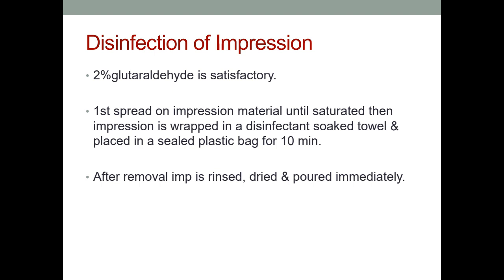This is indicated because if you keep it for more than 10 minutes, there are more chances that the addition silicone will be affected in its dimensions. So you have to take care that whenever you are disinfecting your impression, it should be disinfected for the particular time, and then you have to remove or wash it, dry it and then send it to the lab.